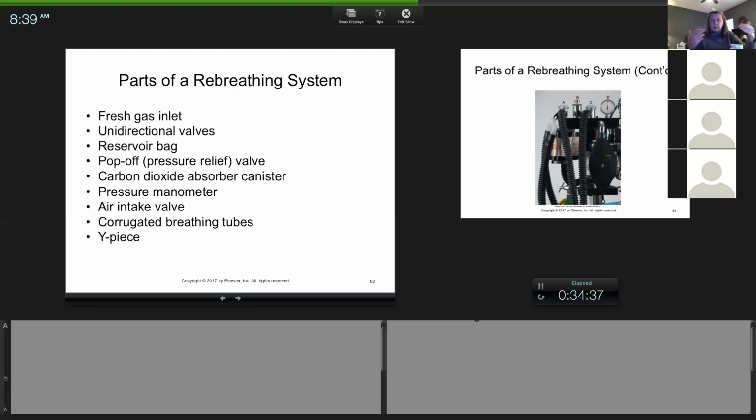Just like I talk about tracing the flow of a red blood cell through the heart, we should trace the flow of an oxygen molecule from the oxygen tank to the patient all the way when they exhale. That's how we should trace the flow through an anesthetic machine. It's very similar, except instead of anatomical parts, I'm talking about machine parts. Same principle.